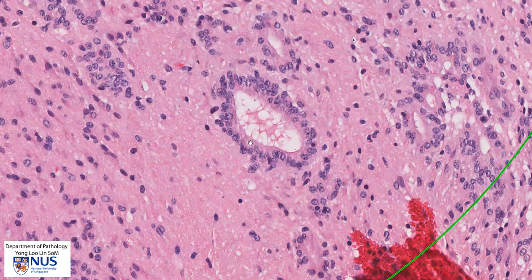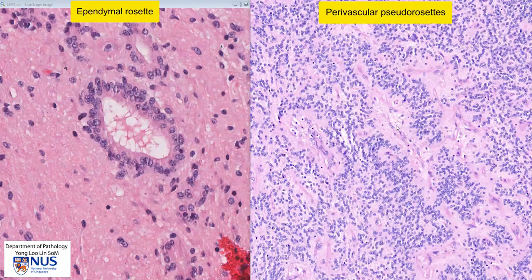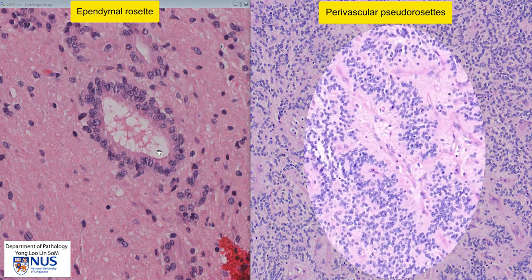Let's do a quick comparison of the two types of rosettes. On the right, we can see the perivascular pseudorosettes with the blood vessel in the center, this fibrillary material and then the nuclei around it. On the left, we can see a true ependymal rosette with a proper central lumen and a very sharply defined luminal border. True ependymal rosettes are actually relatively rare in ependymomas; we most frequently encounter the perivascular pseudorosettes.